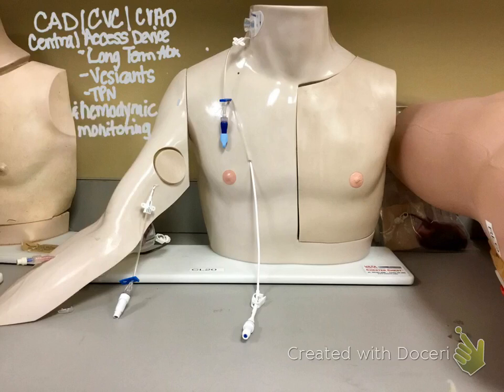And then you can use central lines for hemodynamic monitoring. You will learn more about that when you learn about hemodynamics and the heart. We'll talk more about it, but you can use a central line for that as well.